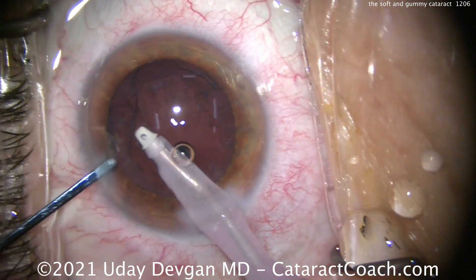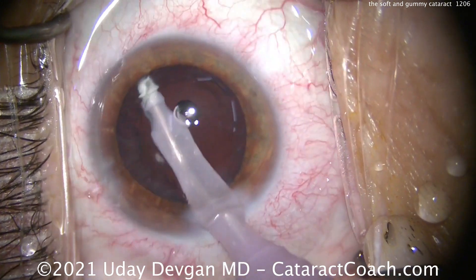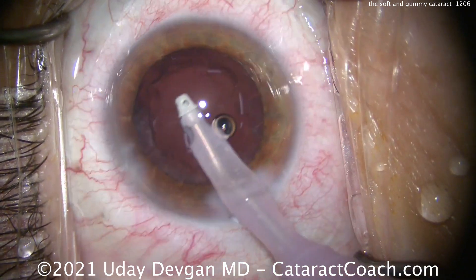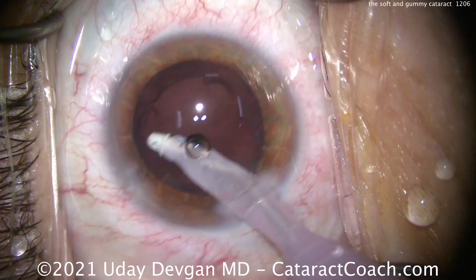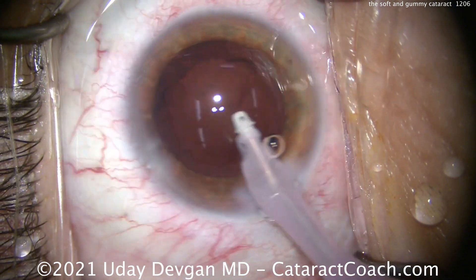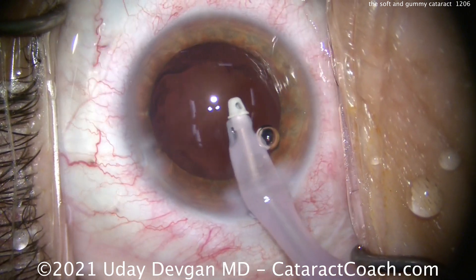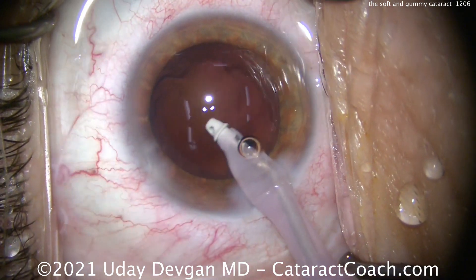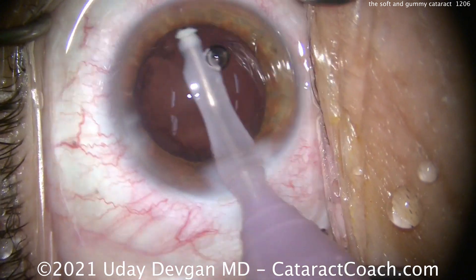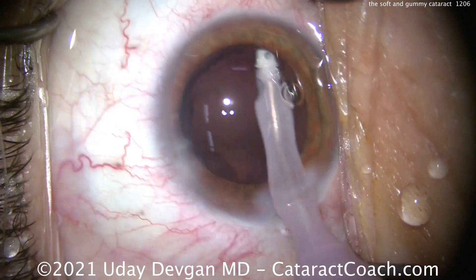In a case like this, being very cautious — this person drives a lot at night and relies on their vision for their job. We better make sure we have a really nice outcome. Let's clean up that cortex. It's going to be a single-piece monofocal acrylic lens, and we're going to aim for a distance vision target of plano refraction, or zero refraction. In fact, this patient basically achieved that with a near-perfect plano refraction and 20/20 distance visual acuity.